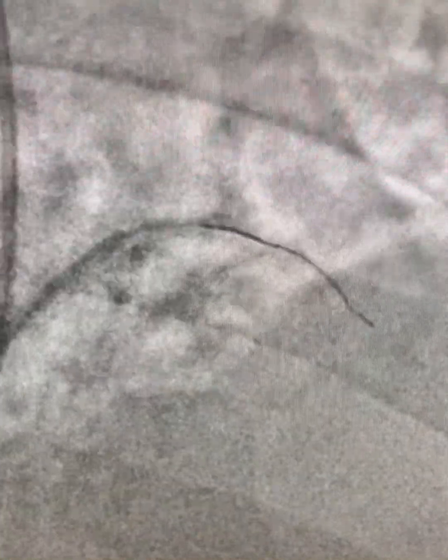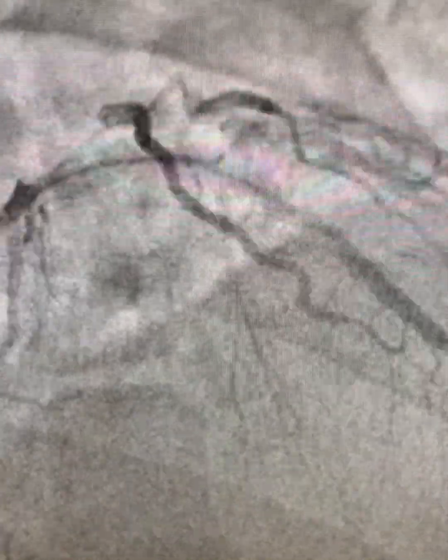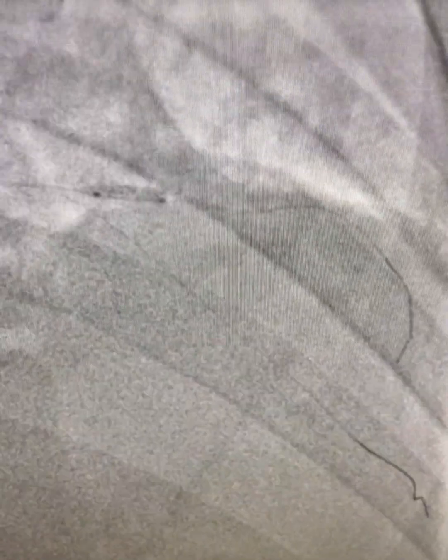As you see here, a 90-degree angulated microcatheter is advanced over a workhorse wire into the main branch. Then after the workhorse wire is pulled back, the microcatheter is maneuvered into the ostium of the branch, and then a polymer jacketed wire is used to cross the lesion. The microcatheter is advanced over this wire, then exchanged for a workhorse wire.